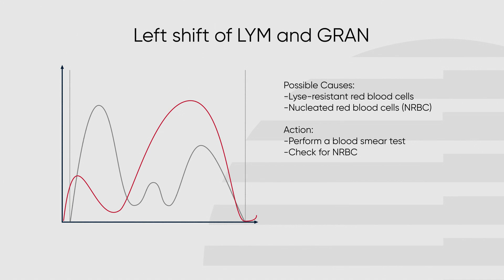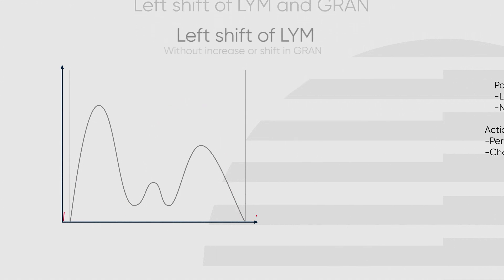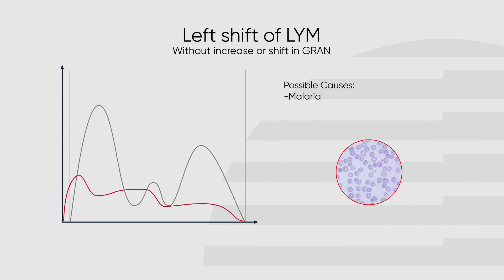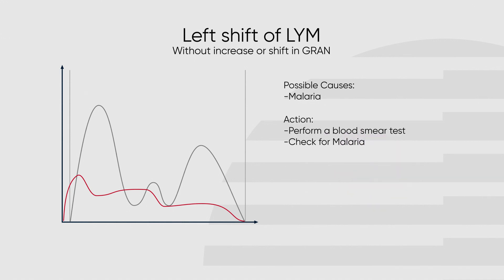If this occurs, perform a blood smear and check for nucleated red blood cells or other irregularities. A left shift of the lymphocyte peak without an increase or shift of the granulocytes may be caused by malaria, as malaria-infected red blood cells are more resistant to lysis and are therefore counted as lymphocytes, causing a false increase and shift of the lymphocyte peak. If this occurs, perform a blood smear and check for malaria-infected cells.